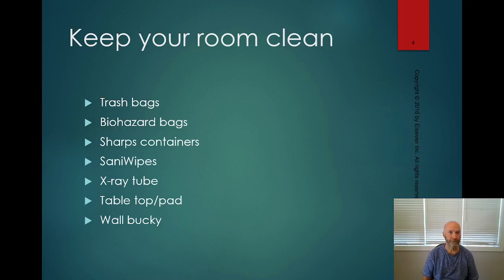And in your room, what you want to do is make sure that you've got plenty of trash bags. You've got a lot of different types of trash bags. You've got the true trash bags, but you've also got the linen bags. Make sure you've got plenty of those. Biohazard bags if you need those. Make sure that your sharps container isn't so full that you can't fit more needles or scalpels or whatever it is that you might happen to be using that day into the sharps container.